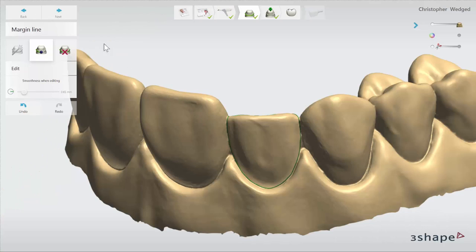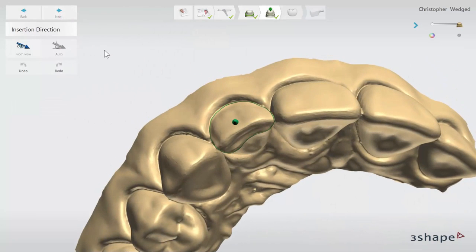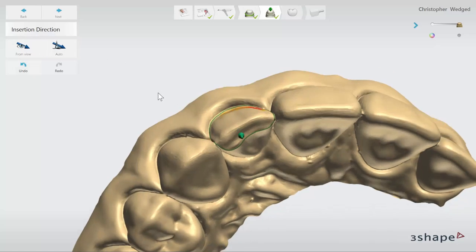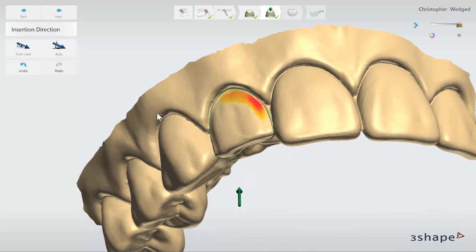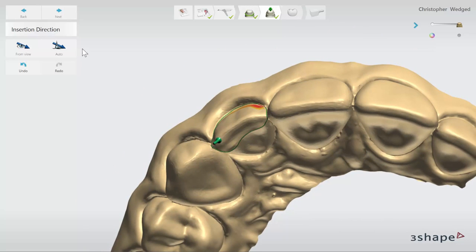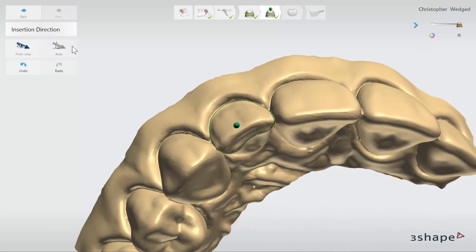When the margin line has been set, click next to move to the insertion direction step. The software will automatically set the insertion direction for your restoration. You can however adjust the insertion direction by moving the view of the scan until you are satisfied and then click the from view button. Make sure that there are no undercuts by looking for any areas which are highlighted in red and yellow. If there are undercuts then you can reposition or once again click the auto button.